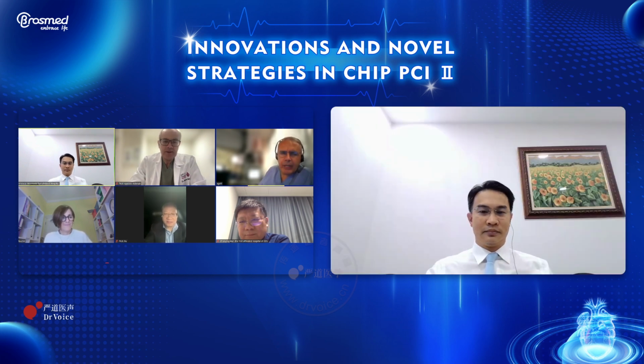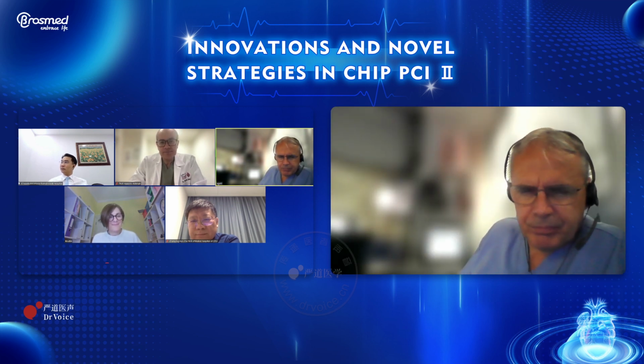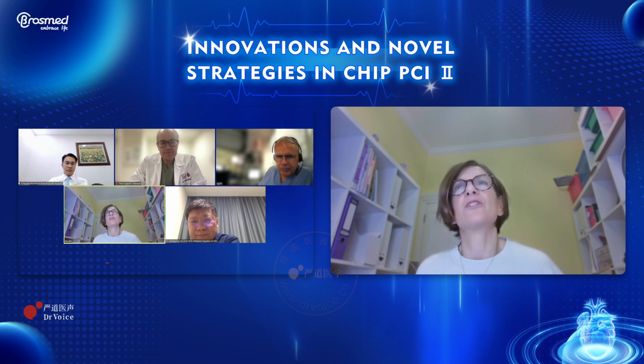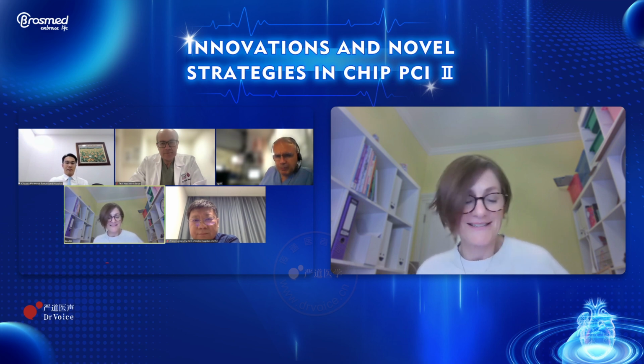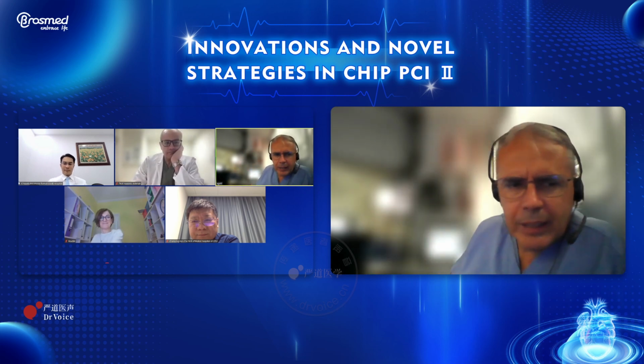Helen, do you have any comment regarding the imaging evidence of the action of the Rebo edge? I've only seen 2 or 3 cases post-imaging, and I think you can definitely see that there's modification. I've used it more in the fibrotic cases, so there's definitely modification of the plaque, which is visible, modification of fibrosis, but more just with a single balloon, without doing a lot of work, you seem to get vessel expansion quite nicely.